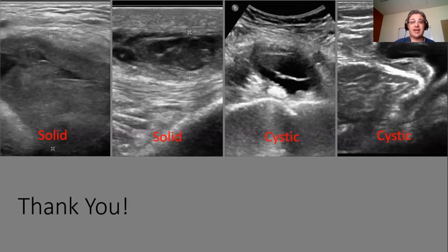And I would say, secondly, as that not being a very common cause of bursitis, I feel as though sonographically, perhaps, ultrasound is not the best tool to evaluate for that type of bursitis. I would go for MRI to evaluate for inflammation in the region of that named bursa.